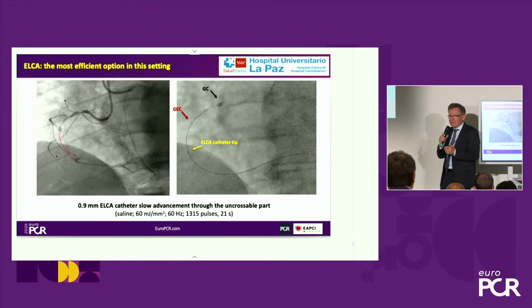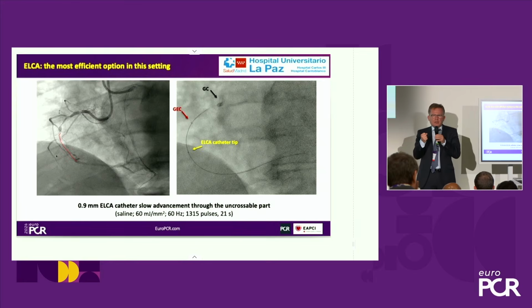But what Mohamed said, it was lesion preparation. What we are facing now is that we must think about the perfect lesion preparation. It's not only like in the BRS era that it was necessary to perform like that. I think that now we must prepare all lesions as much as possible for stenting. And a modality like laser just gives you such an opportunity.